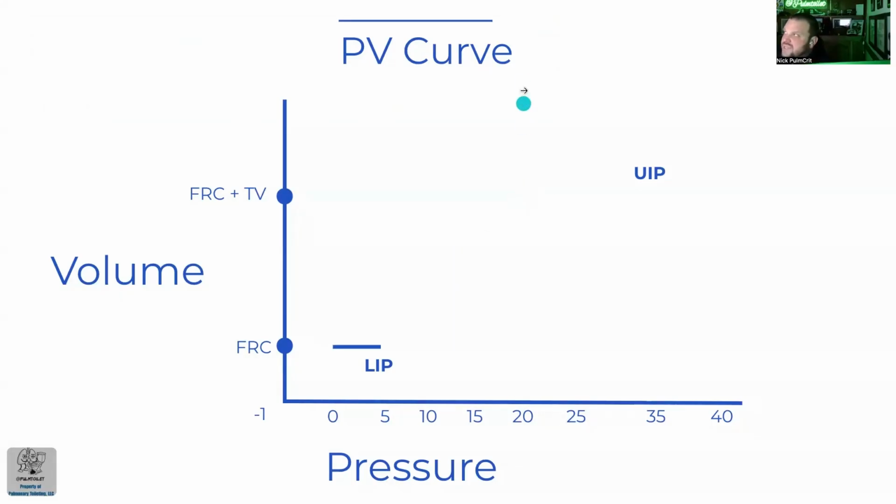So the next key concept to get into is the pressure volume curve. I don't want this to be too nebulous, but the pressure volume curve basically says if you are putting volume into the lung, that's going to cause some pressure to be exerted. If I change my volume and I'm getting a pressure change, it's 8th grade, or 9th grade, probably 10th or 11th grade for me, but 11th grade math is rise over run. So the slope of this line becomes your compliance.